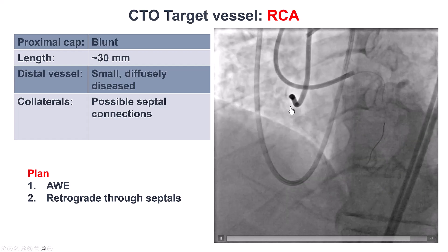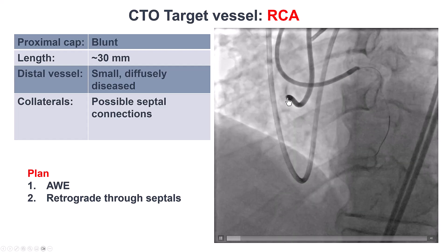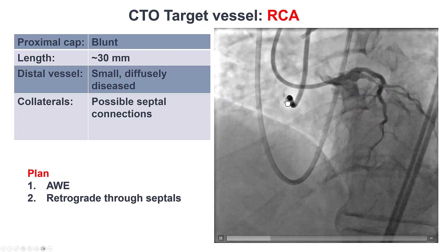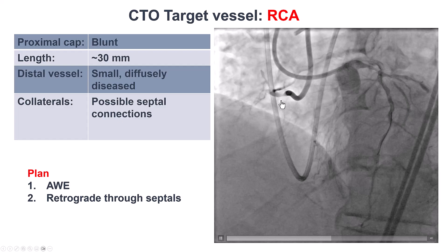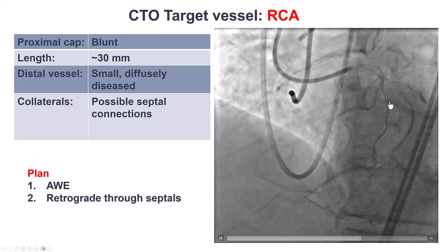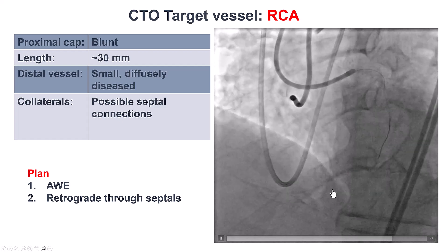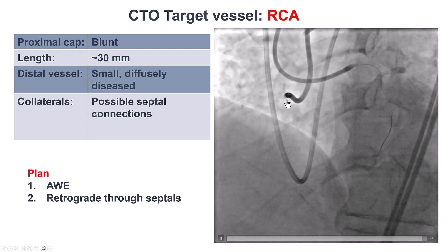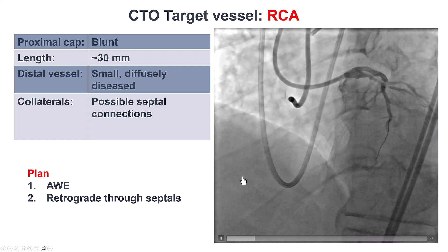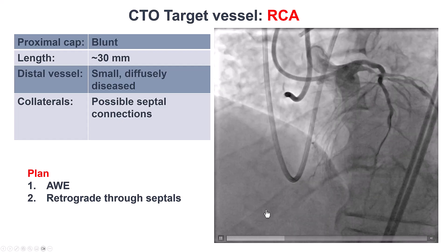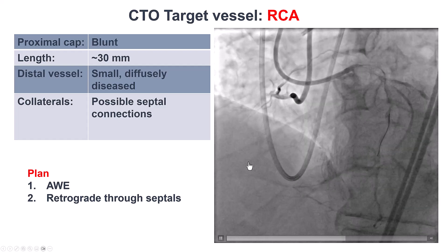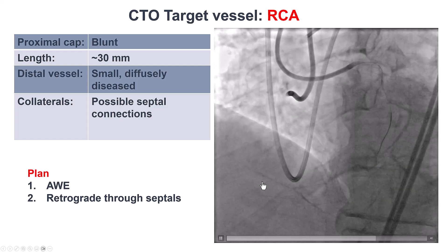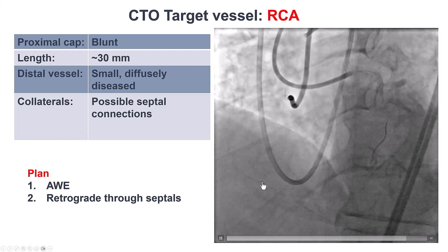The plan was to first try antegrade wire escalation, and if that didn't work, try to go retrograde through septals. ADR was less favorable here because of the small, diffusely diseased distal vessel.